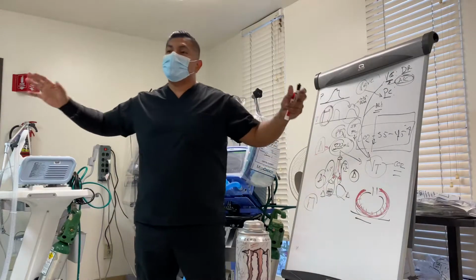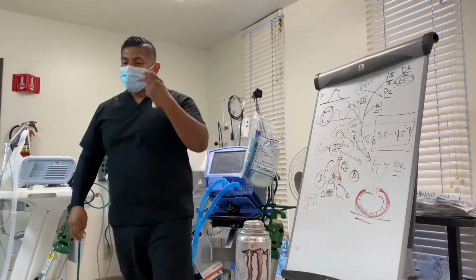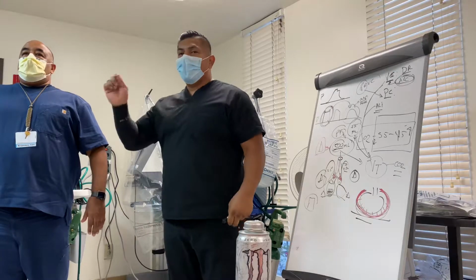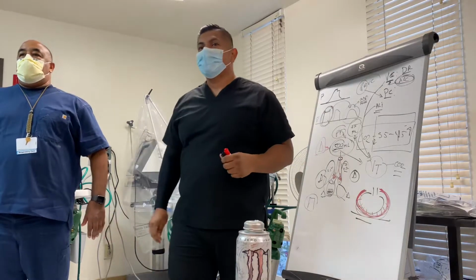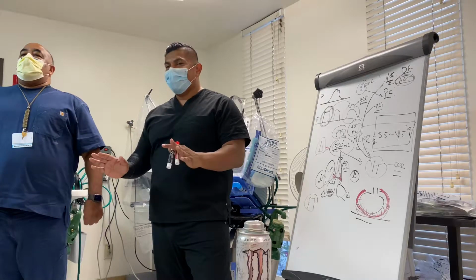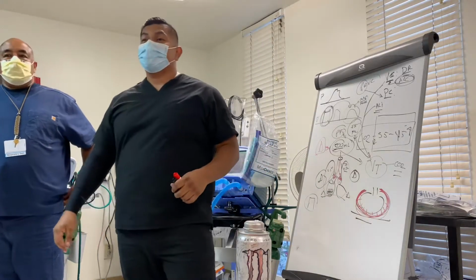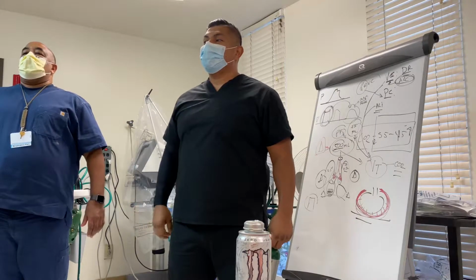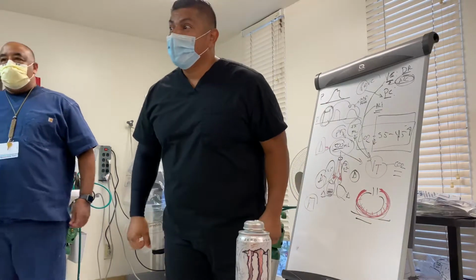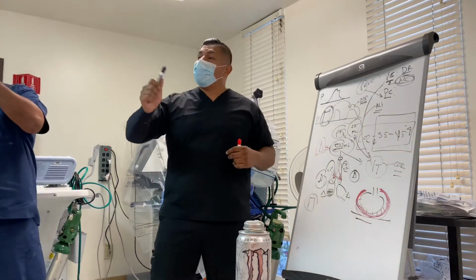Can everybody do me a favor? Everybody take a nice deep breath and hold it. Dave, I want you to give my example. Stand up. Everybody take a look, Dave. Oh, don't look at me. Take a deep breath. Hold it. Anybody notice what happened with Dave? Exhale. Take a deep breath again. Hold it. Exhale. What happened to Dave's chest? Expand. But what happened when I said hold it? Take a deep breath. Hold it. Everybody take a deep breath and hold it. What happened to your shoulders? It dropped. And that's what PRVC is going to focus on.